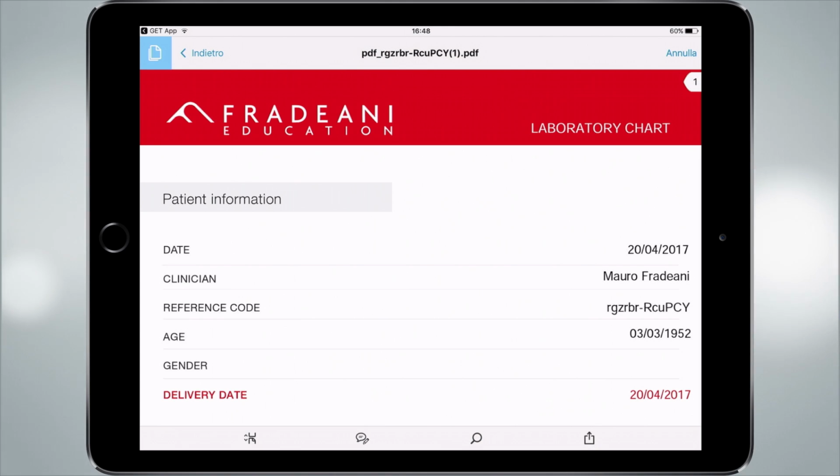We are still working on the app, improving many different steps day by day. We are in a position to improve the final outcome of the app without any kind of additional payment. It will be automatically found on the app when you open it.